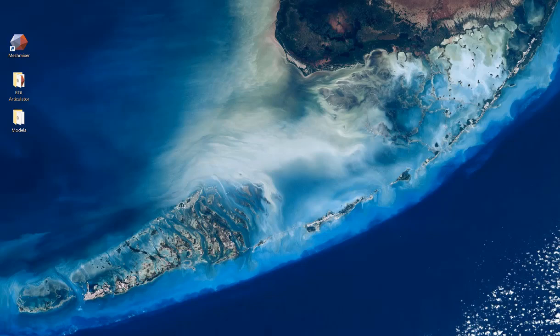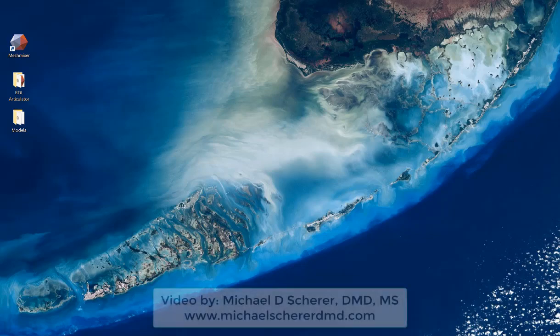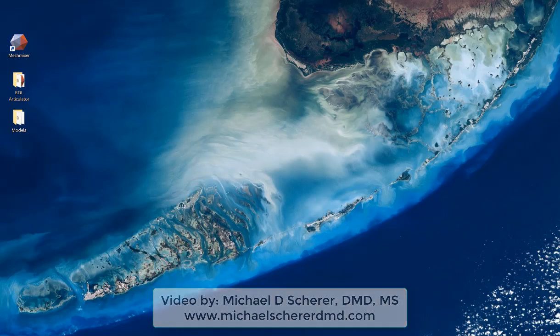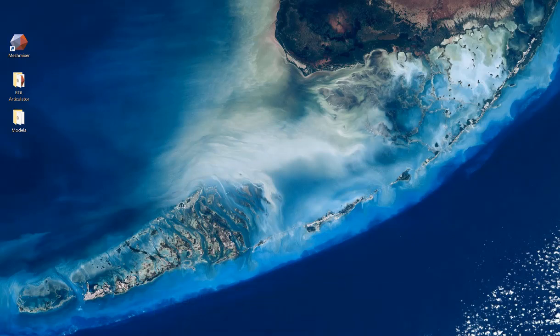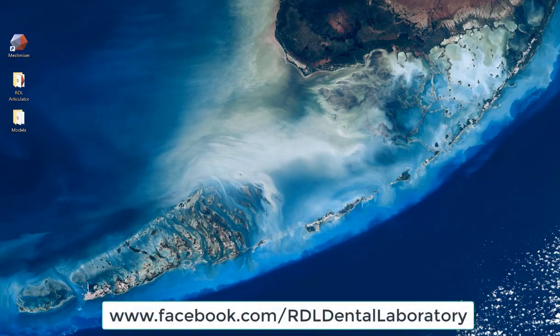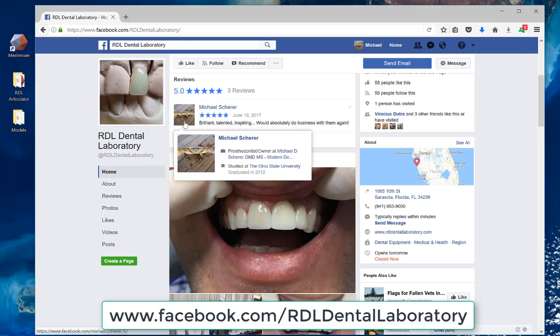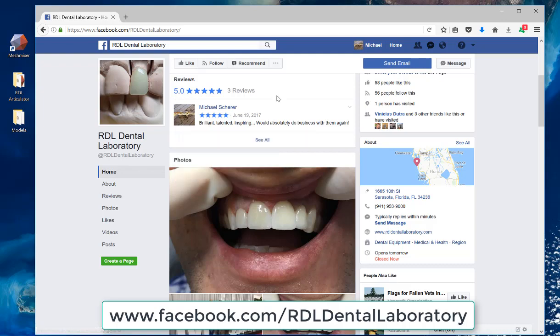Okay, everyone. In this video, we're going to show you how to convert one of my patient intraoral scans into working dental models on an articulator.